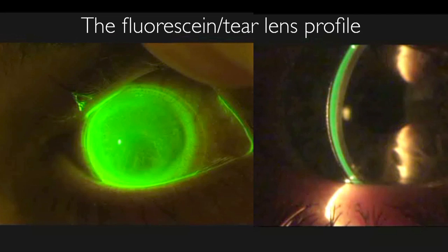If we look on the left at our fluorescein pattern, we see we have a fully vaulted eye, but we have no idea how far away that lens is from the cornea. We have no idea how thick that tear lens is. Is it too thick or not? We don't know.